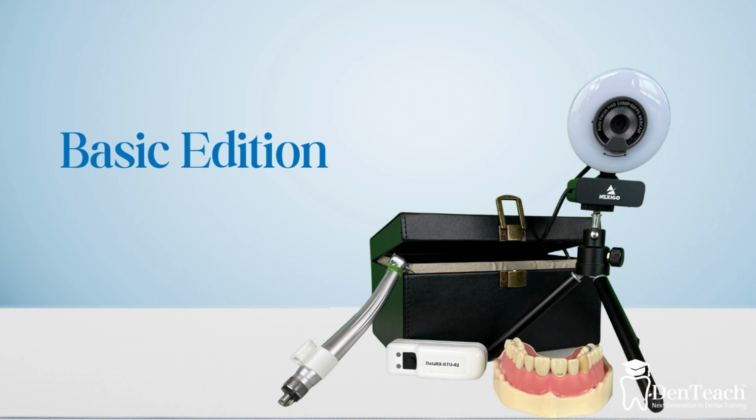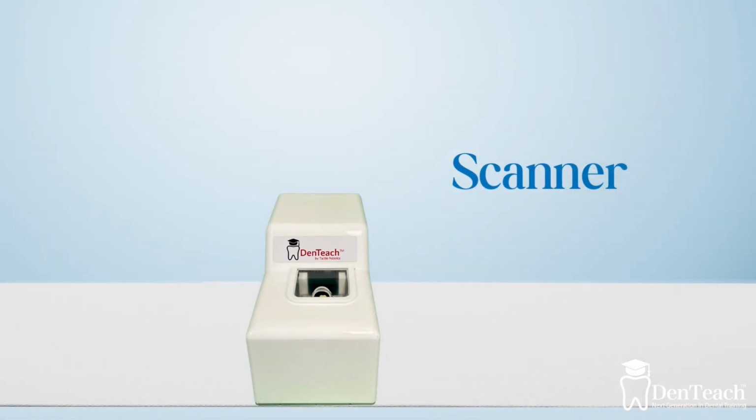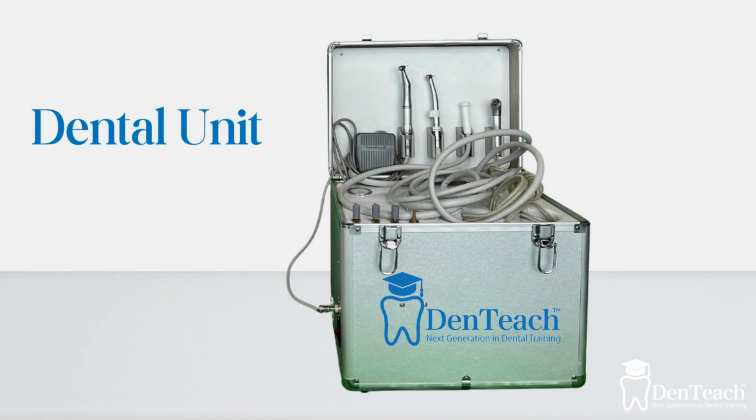We have recently added a basic edition and scanner to our offerings. The DenTeach Dental Unit is another optional add-on that can be used with the DenTeach system.